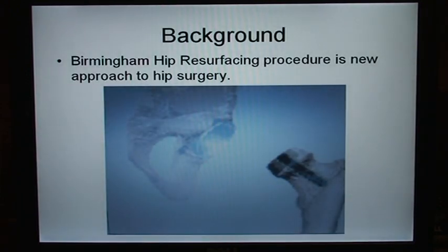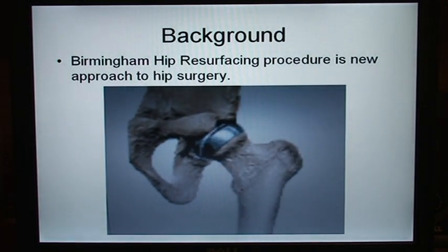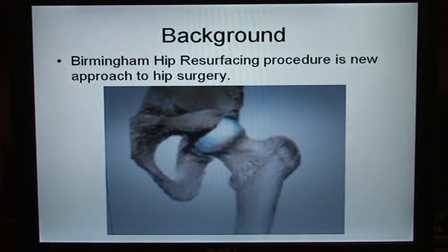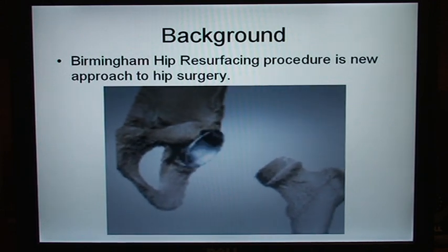To give you a little background, the Birmingham hip resurfacing procedure is a new approach to hip surgery. The Birmingham hip resurfacing system is a metal-on-metal resurfacing artificial hip replacement system surgically implanted to replace a hip joint.